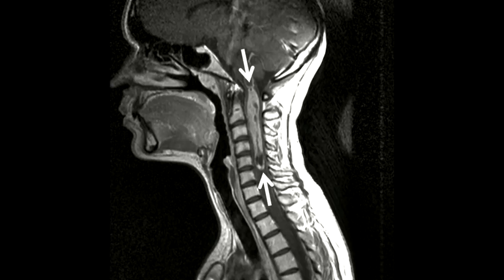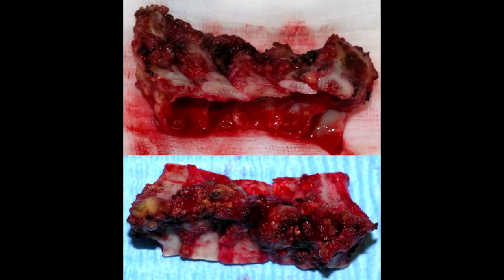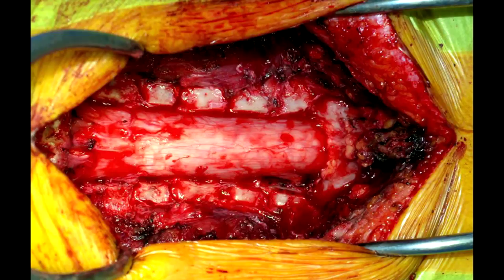After positioning of the patient in the prone position and opening of the skin incision, laminoplasty was performed from C2 to C6, where the lamina was removed in order to return it again after the operation.